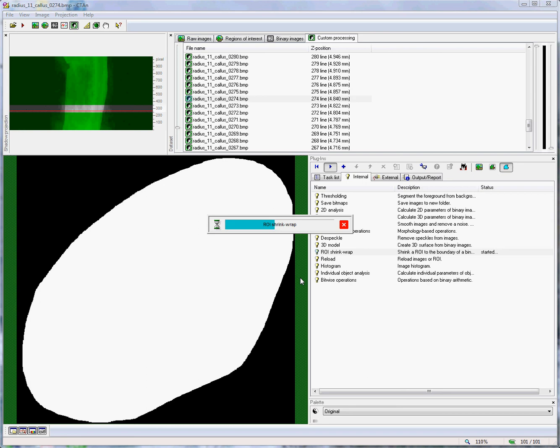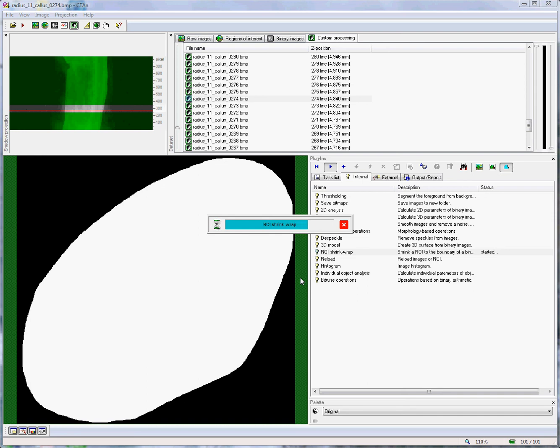Note also that here we are performing shrink wrap in 2D, which means that it is shrinking from the periphery on each two-dimensional slice. In this case, this is preferable to 3D, which would include shrinking from the cut top and bottom surfaces. In this case, it is sufficient and adequate to shrink wrap the section from the periphery using the 2D option. Another factor is that the 2D shrink wrap takes a shorter time than 3D. If you have a whole object in three dimensions, just a particle, then the 3D shrink wrap can, in that case, be appropriate.